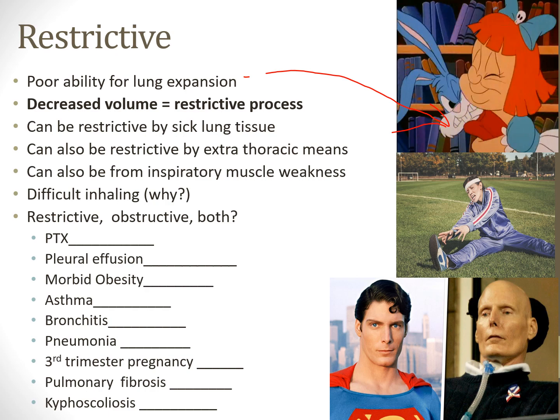So anytime we see low volumes on a pulmonary function test, we're thinking a restrictive process is happening. This can be caused by sick lung tissue, like I said, with pulmonary fibrosis, where the lungs are scarring up, or ARDS, where the lungs are filled with a bunch of fluid and scarring up, right? So that could be restrictive due to sick lung tissue.